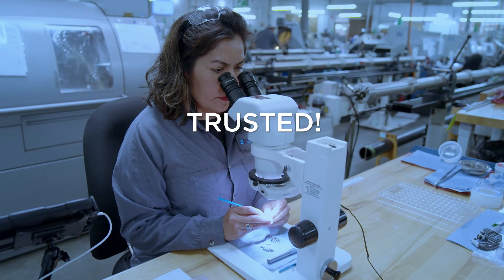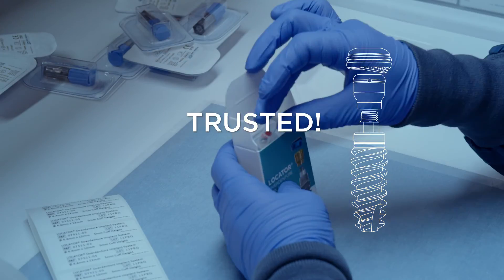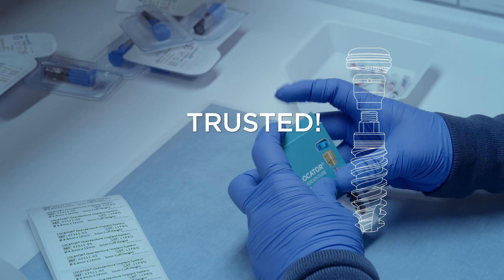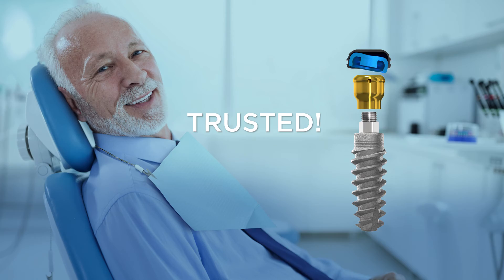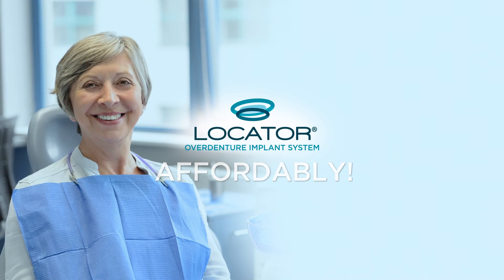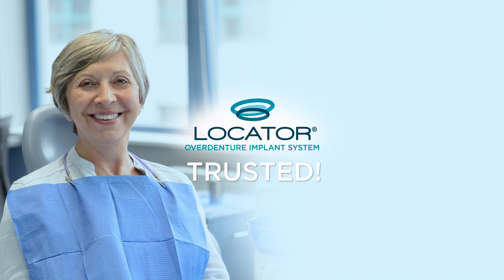American-made and manufactured, Locator Implants deliver the consistency you've come to expect from Locator products. Precisely manufactured implants from the most trusted name in dentistry. Stop paying more and start getting more with the Locator Overdenture Implant System.